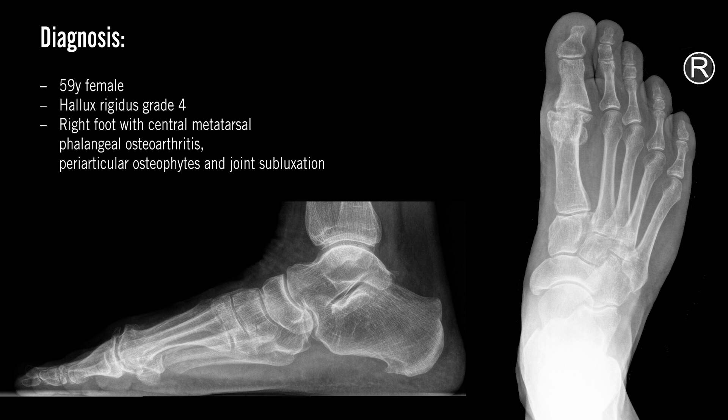In this case, we will perform the fusion of the MTP1 joint with a plate and an oblique metatarsal phalangeal screw.